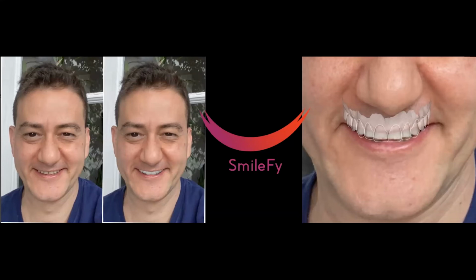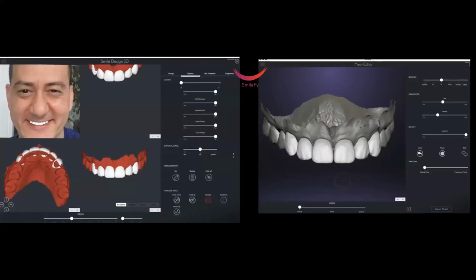This is me. Of course, if I don't believe in something, I don't do it. For this reason, I believe in this app. I believe in Ralph. I believe in all the work he does. I took a selfie, I auto-designed, then I shared it to Ralph. I told Ralph, please design me in 3D.